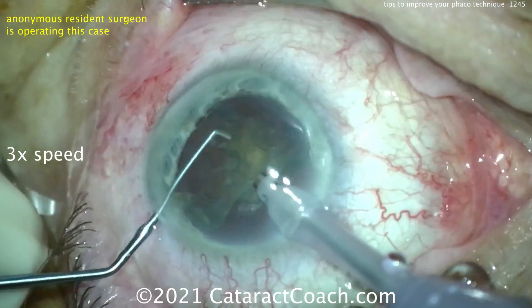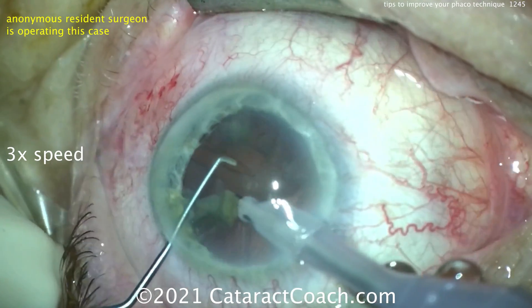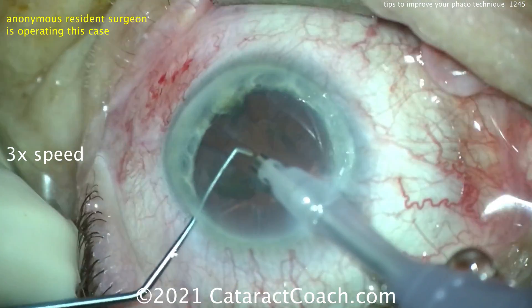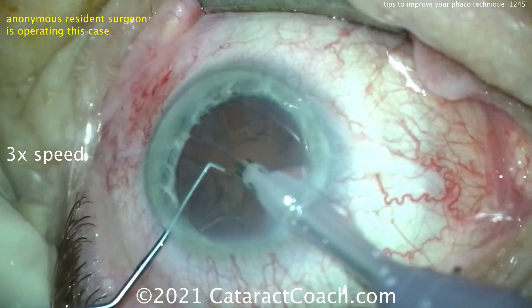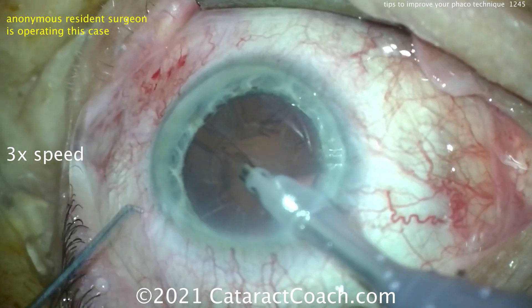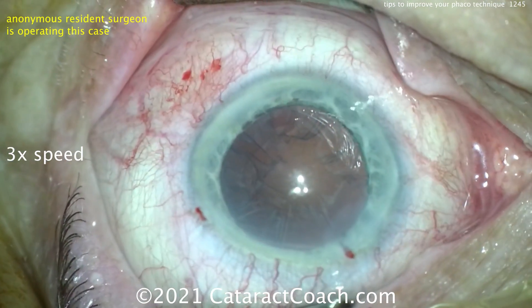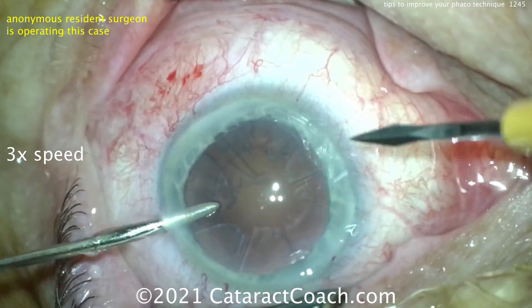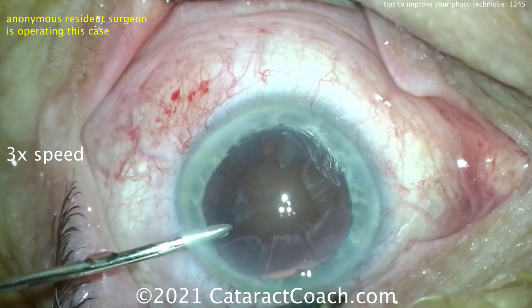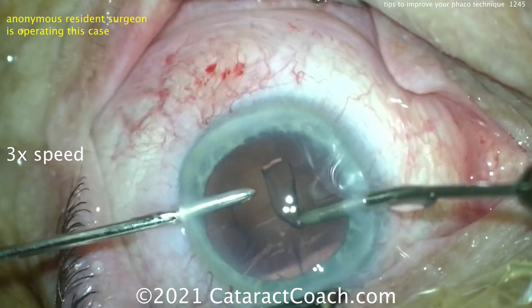You've got to fix this — your patient positioning is not great. There's a video on cataractcoach.com for patient and surgeon ergonomics. You want the patient's iris to be parallel to the floor of your room. Now that's a lot better — a lot more in primary — but when you have the instruments in the eye the eye fell out of primary. Look, your technique is great; for 20 cases in, that was a very nice divide and conquer, but we've got to work on some finesse things.